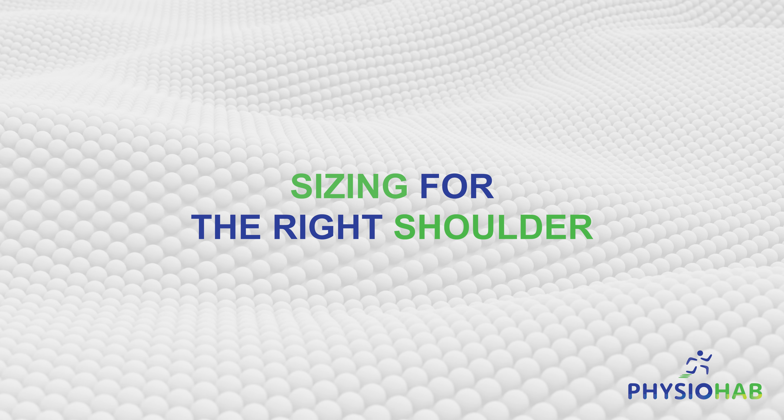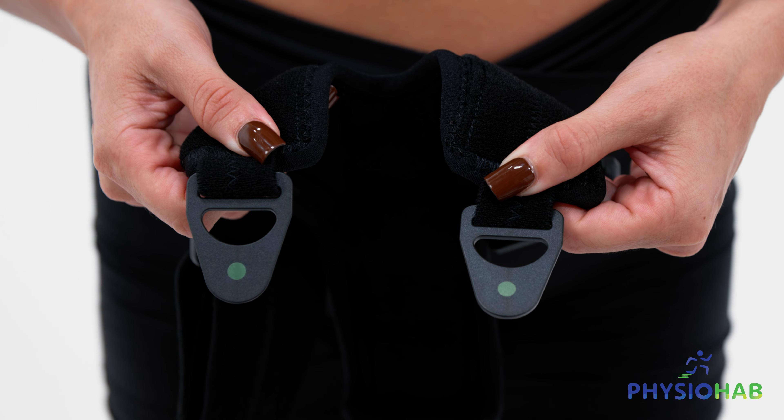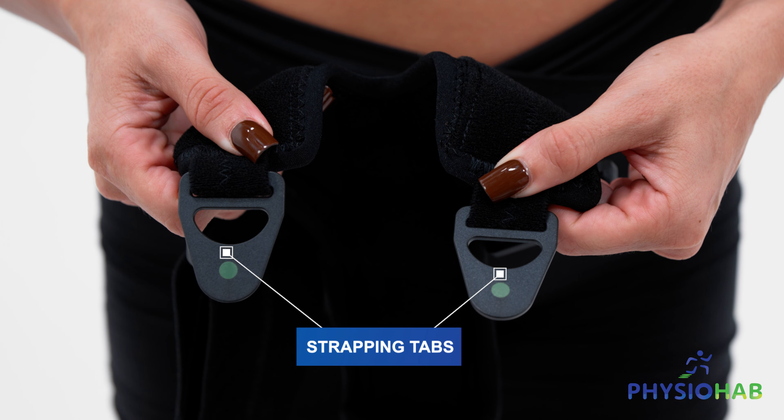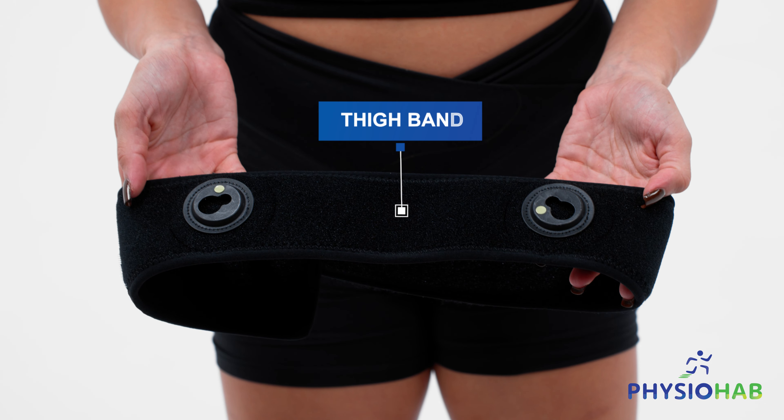Sizing for the right shoulder. For individuals rehabilitating their right shoulder, start by snapping the two tabs found at the end of the strapping system, denoted with green stickers, onto the open slots found on the thigh band, also marked with green stickers.